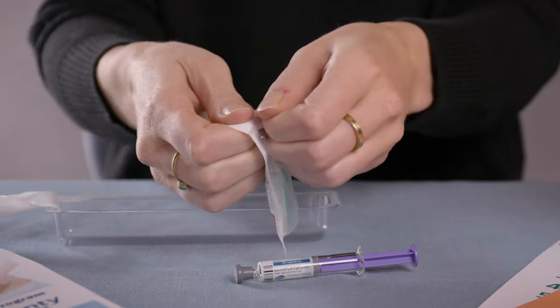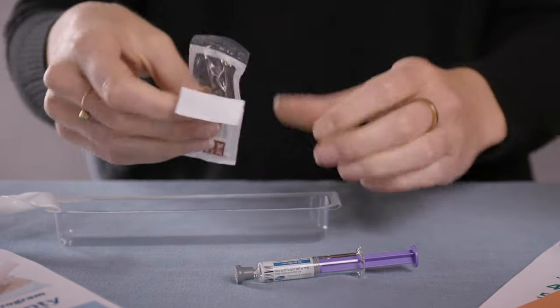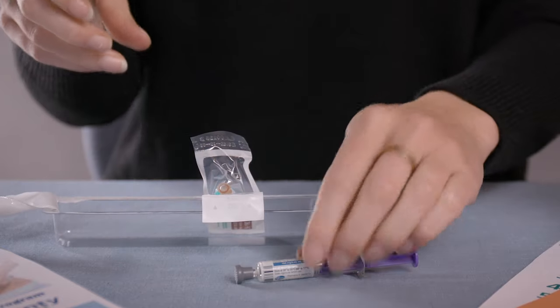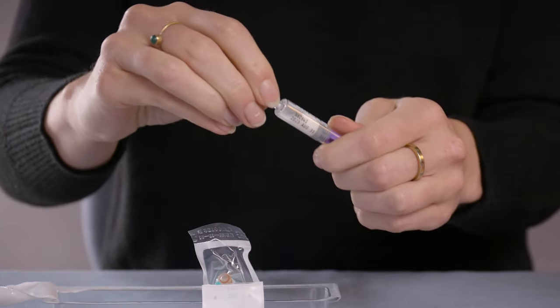After shaking the syringe, carefully open the package containing the needle. Do not remove the needle from the package yet. Set the needle down back in the plastic package.